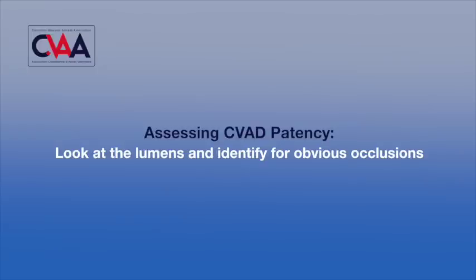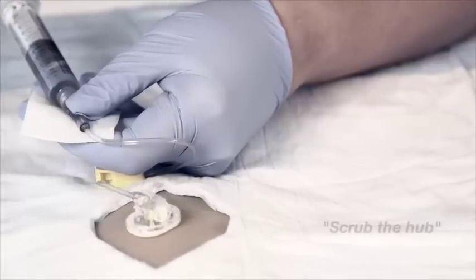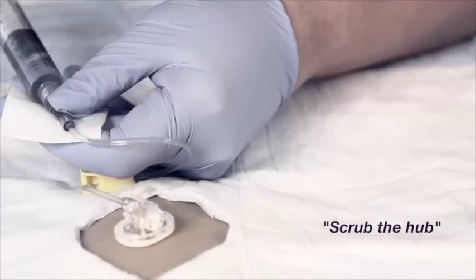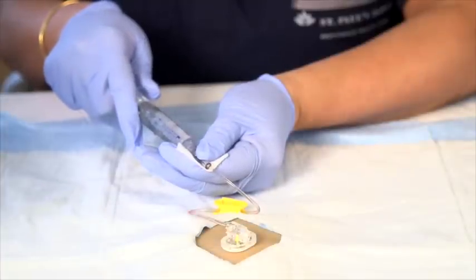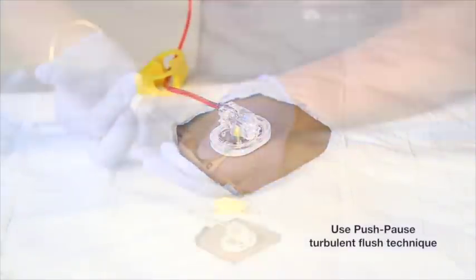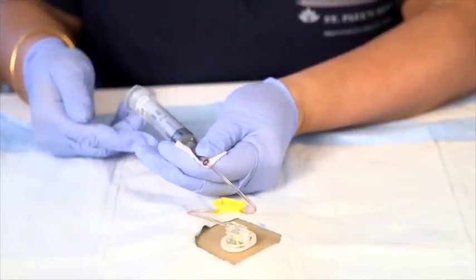We are going to assess for CVAD patency after you look at the lumens and identify if there's any obvious occlusion in the extension set or the needleless connector. We're going to scrub the top of either the needleless connector or the open lumen hub. Attempt to aspirate. If you cannot do that, you're going to flush 1 to 2 mils and then proceed to gently aspirate, pulling on the syringe plunger. Once you see blood come back easily, you're going to flush the lumen using a push-pause turbulent flush technique.